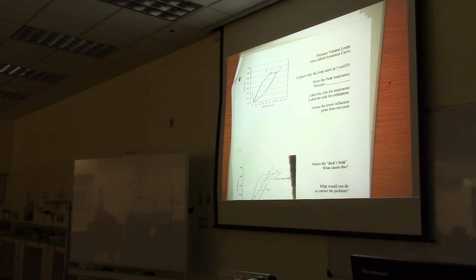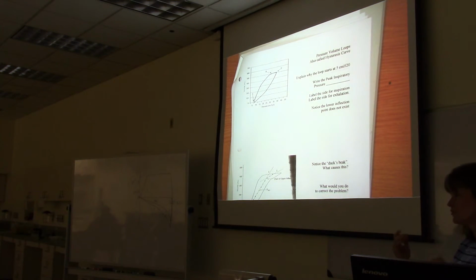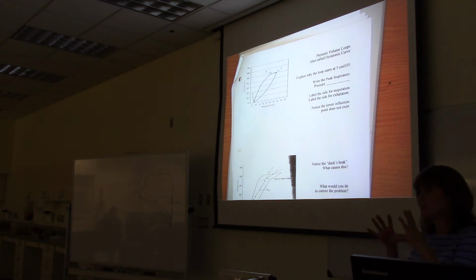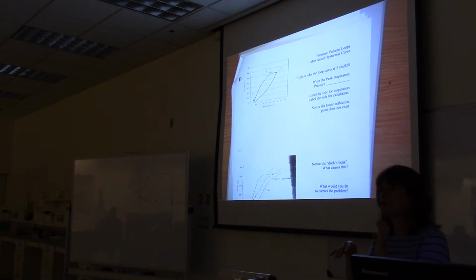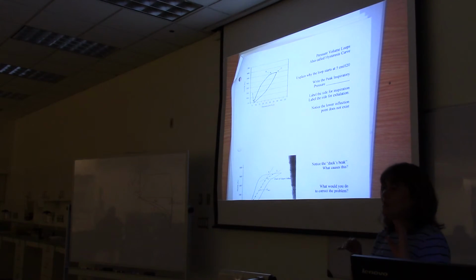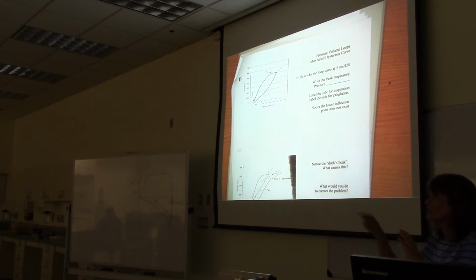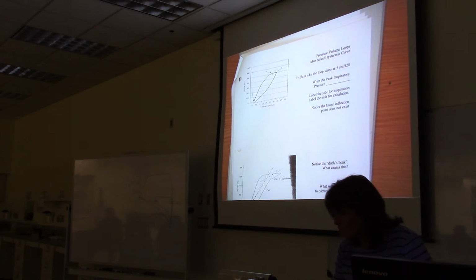Next thing it says is notice the lower inflection point does not exist. So I'll explain it to you right now, but you don't have to write it down because we'll go through it in detail in a little bit. When the lungs are empty, sometimes all the alveoli collapse, and when the next breath of air goes to fill up the lungs, before the volume can go in, a lot of pressure builds up just to try to get those alveoli to open back up again. And when you look at a hysteresis curve, you can see a lot of pressure, then all of a sudden air starts going in. So I'm going to show it to you on this lower curve.